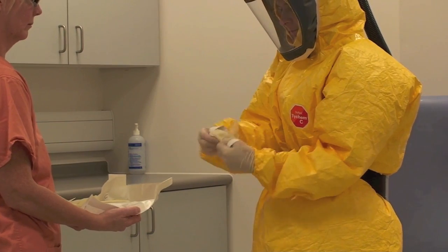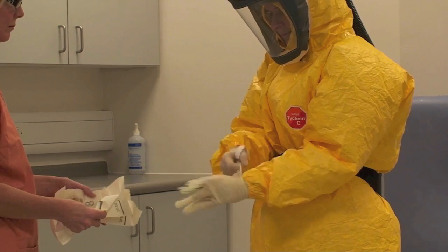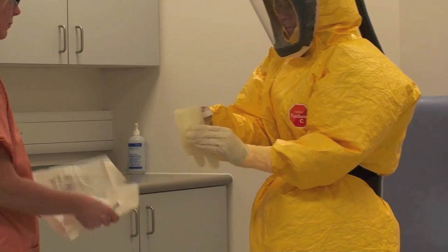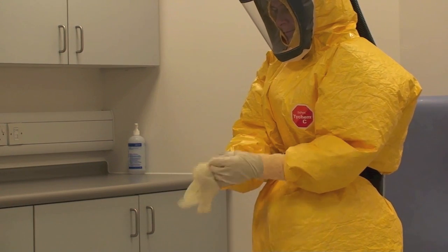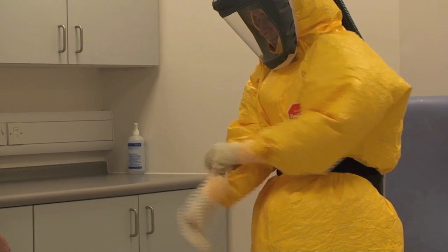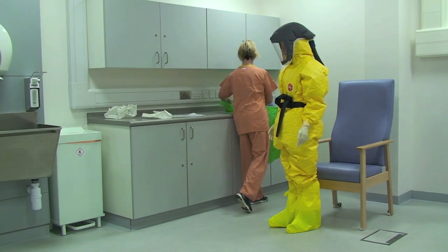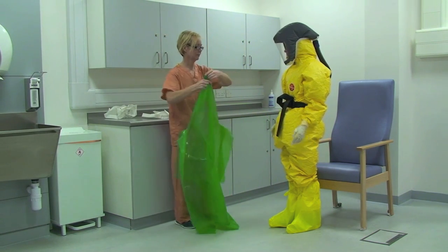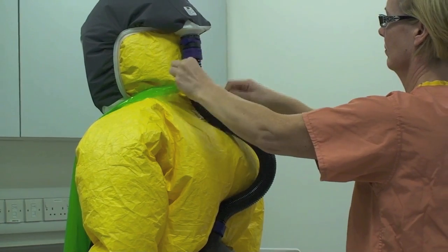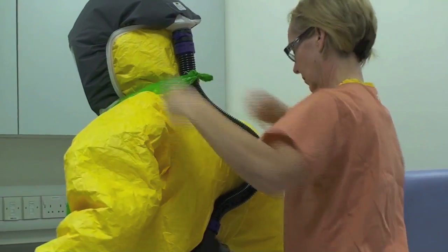Ensuring the thumb hoop is in place, the healthcare worker then applies a second pair of sterile gloves. The buddy assists the healthcare worker to put on the green apron, tying the apron up to the neck and waist to hold the air fed hood hose in place.